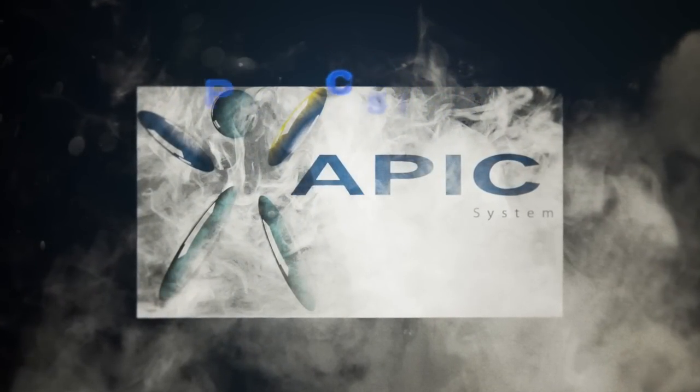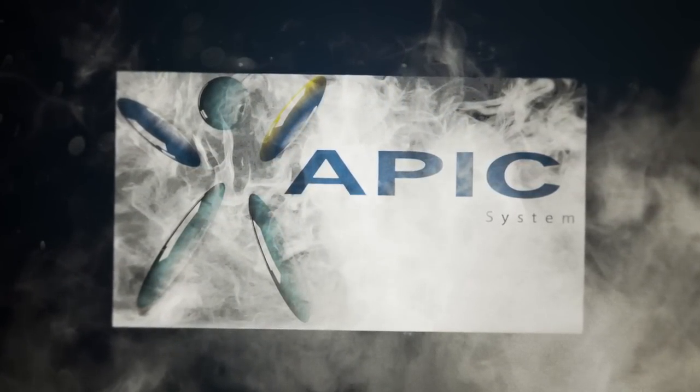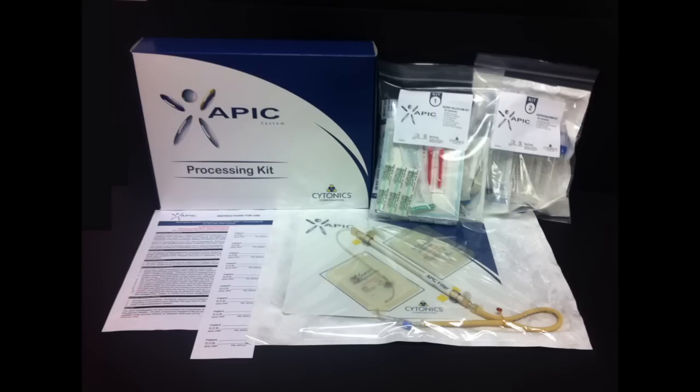The APIC processing kit contains three individual kits for each processing step. Kit number one contains the components for blood collection, kit number two contains the components for the centrifugation step, and kit number three contains the components for the concentration step.